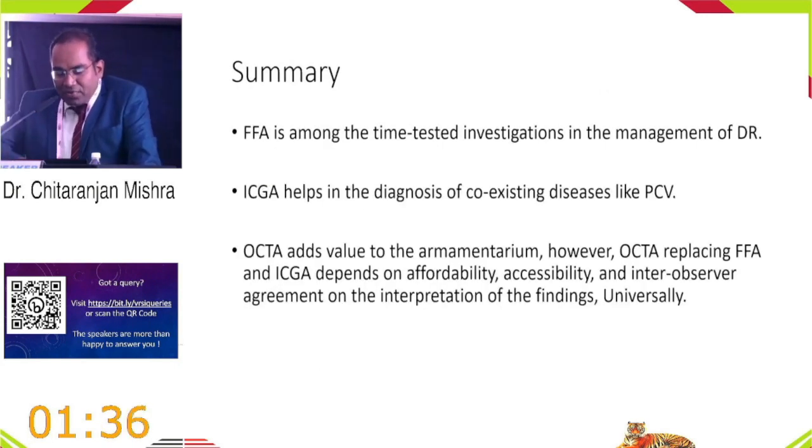So in summary, FFA is among the time-tested investigations in the management of DR and many other diseases like peripheral diseases, PH, CR, FEVR, and angiomas. ICGA helps in the other coexisting diseases, especially PCV. OCTA, yes, it adds value to the armamentarium.